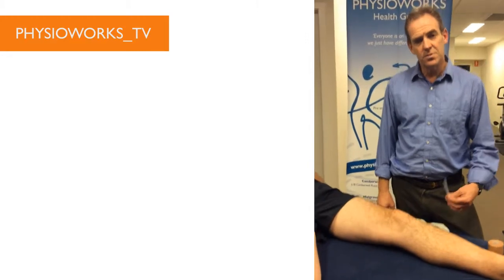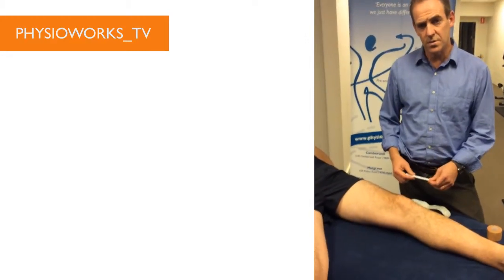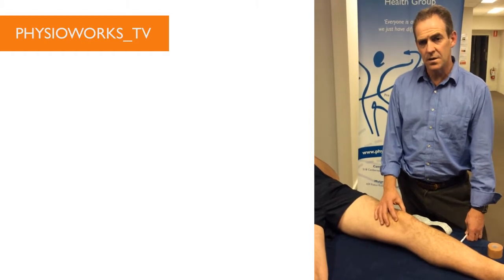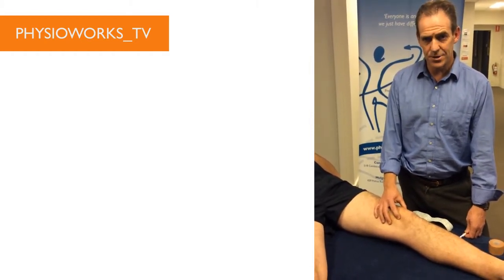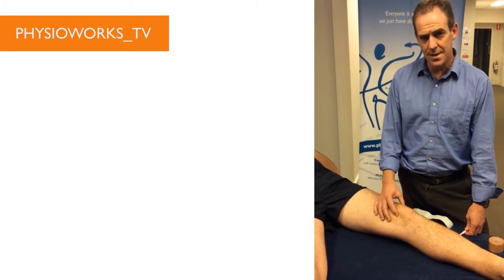One of the most important things with this protocol is ensuring that we can reproduce the taping technique which you would have been taught at the treatment consultation. So I'd like to take you through that today.